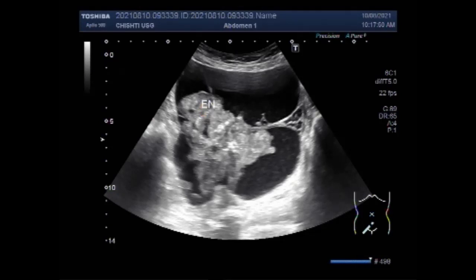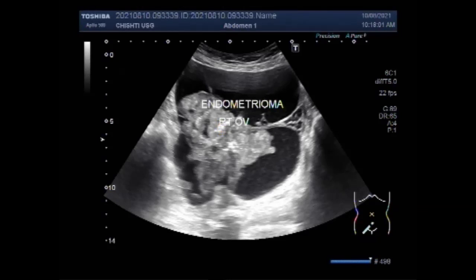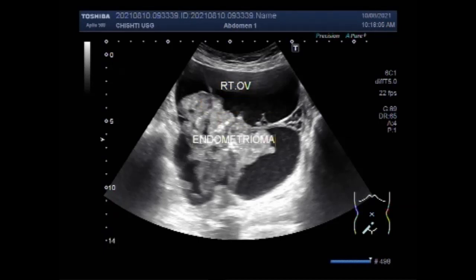This is the so-called chocolate cyst. However, many other appearances have been described, including an anechoic cyst, a solid appearance, solid-appearing mass, and solid elements within the cyst. As you can see, there are solid elements in the cyst.